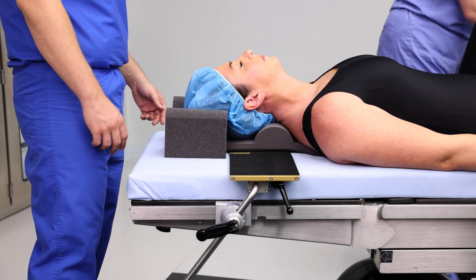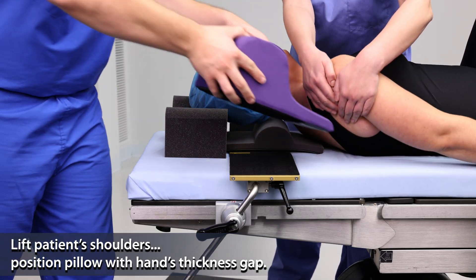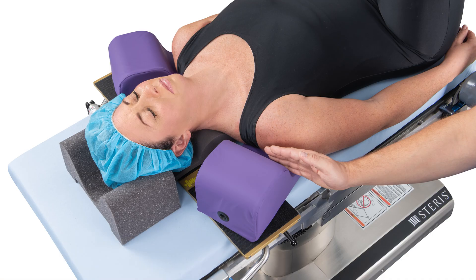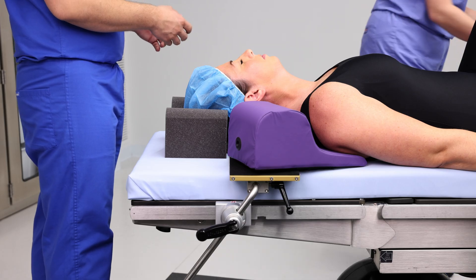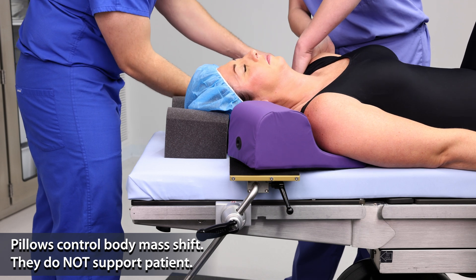To install lateral stabilizing pillows, lift the patient's shoulder and position the pillow, leaving a gap of about a hand's thickness between the pillow and the patient's shoulder. These pillows do not support the patient — they simply control body mass shift.